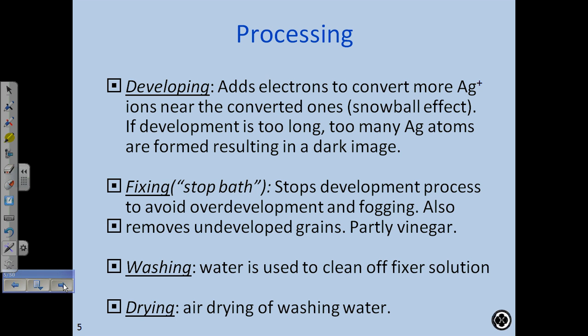A processor in general, the modern processors, they're usually quite large. They made a few tabletop versions of it, but they're usually quite large, and they're large because they have to hold these chemicals in baths. So the first chemical that the film is exposed to is the developer. The developing stage is a chemical in a container, and the film goes in, and there's usually some automated wheels that push the film through this bath. The rollers are tight and they hold the film.